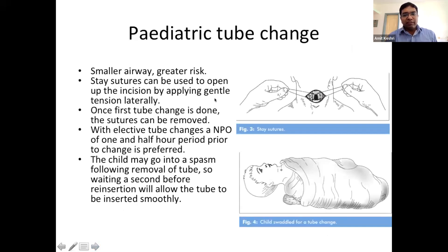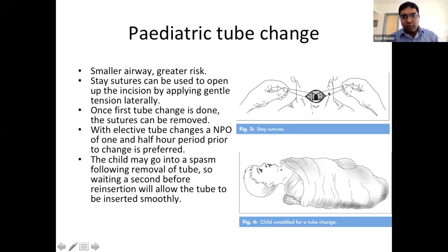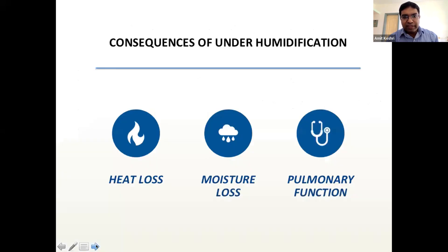Paediatric tube change is very important. The stoma opening in neonates is very small. Place two stay sutures on both sides of the stoma, hold them laterally while removing the tube, and use them to guide reinsertion of the new tube. This technique is essential in paediatric tracheostomy management.